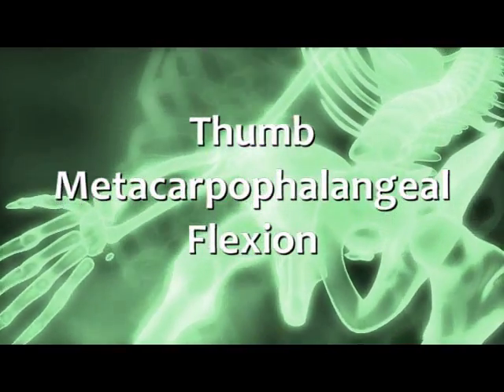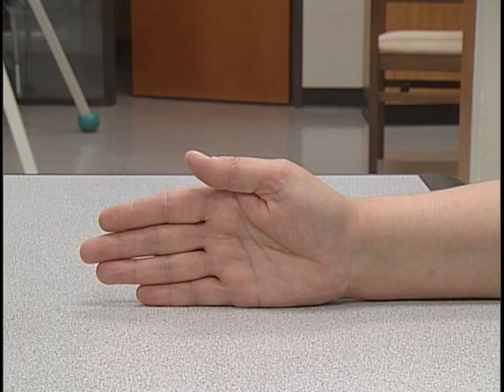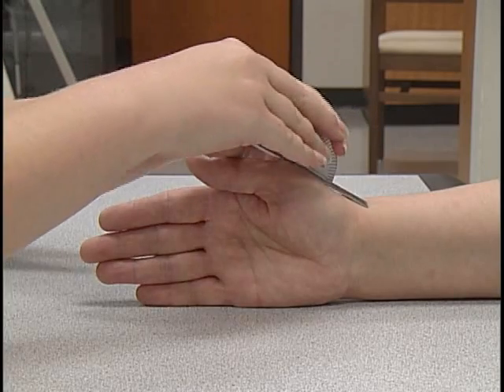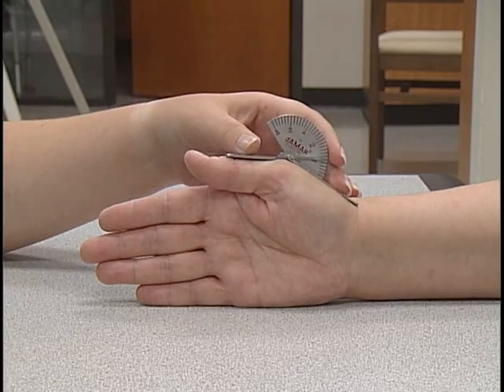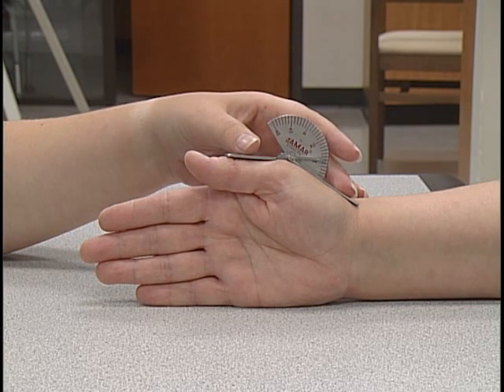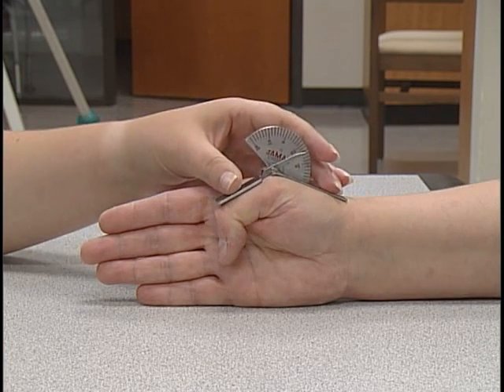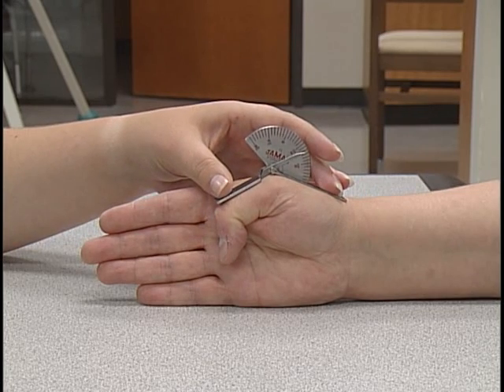For thumb MP flexion, the subject is seated with the forearm in 45 degrees of supination, the wrist at zero degrees neutral, and the forearm and hand supported on a firm surface. The axis of the goniometer is on the dorsal surface of the MP joint. The stationary bar is over the thumb metacarpal and the movable bar is over the proximal phalanx. The client's thumb distal of the MP joint is flexed down. The measurement begins at zero degrees and can range up to 50 degrees.